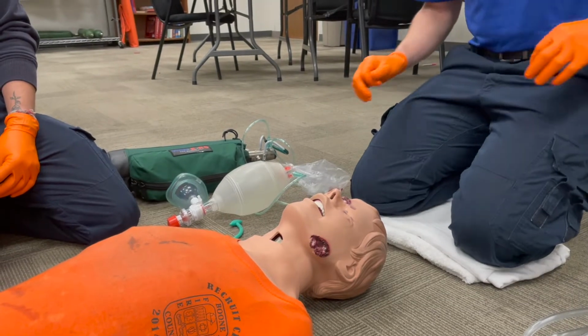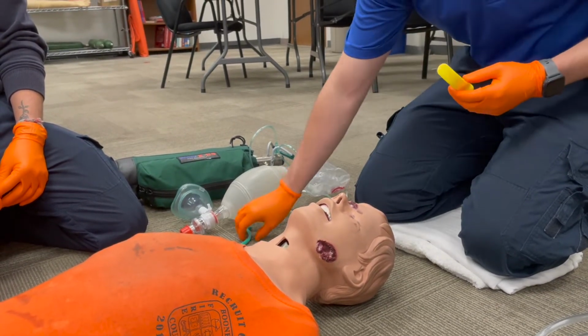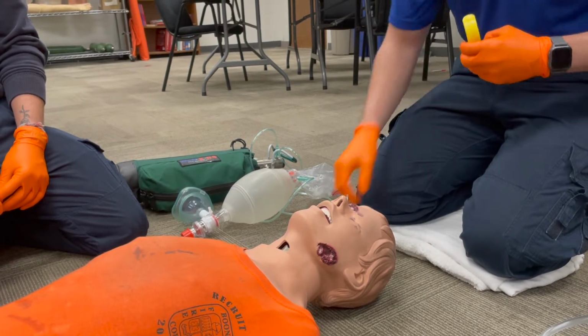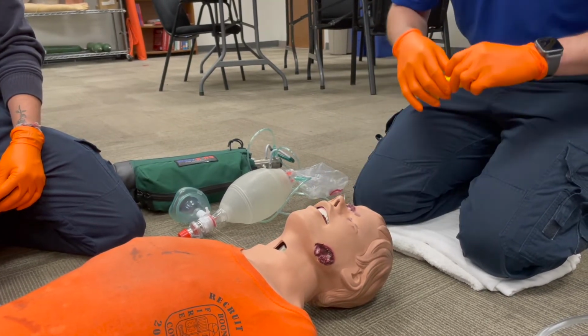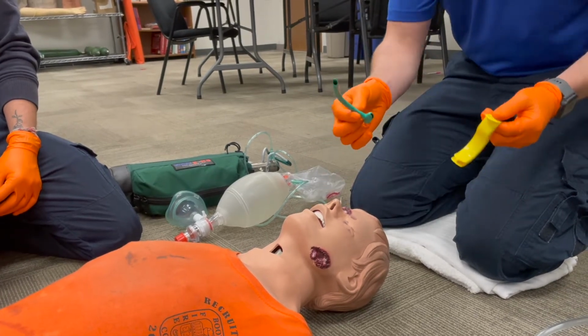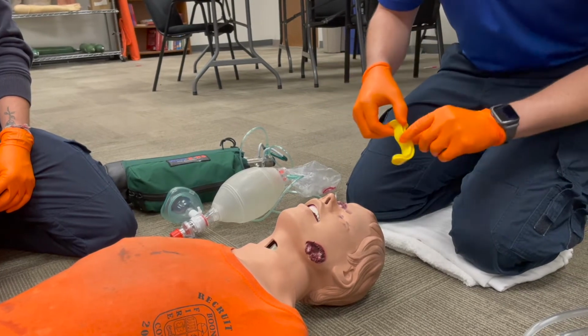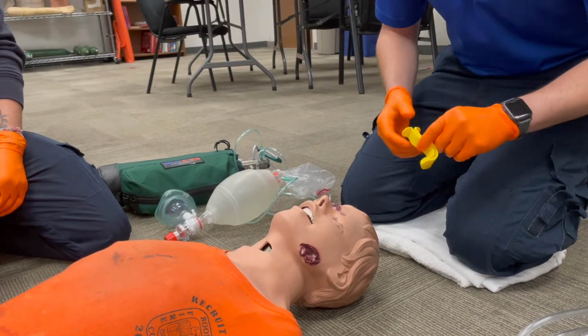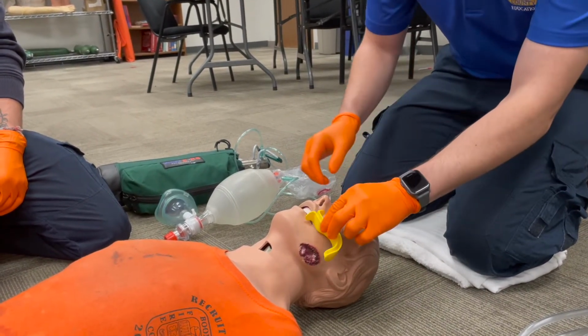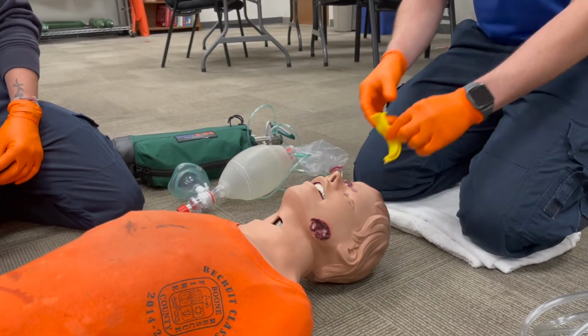Most of the time when you are going to be manually ventilating a patient, you want to use some sort of adjunct airway to help hold their airway open. So that could be either an oropharyngeal airway or nasopharyngeal airway, an OPA or an NPA. You should know that the correct way to size an OPA is from the corner of the mouth to the angle of the jaw. So that looks about right for this patient.